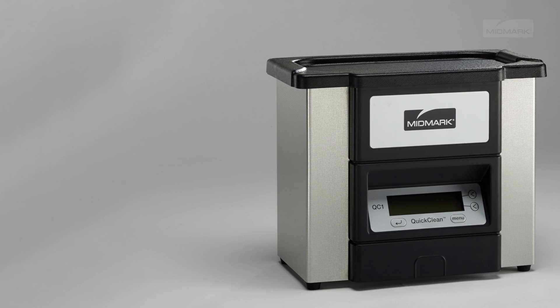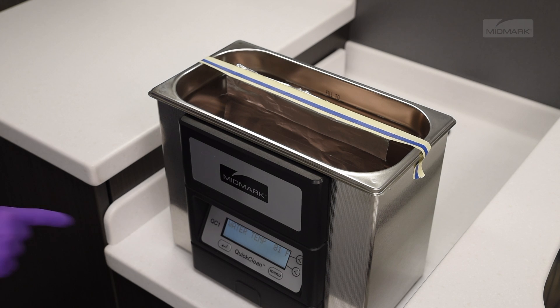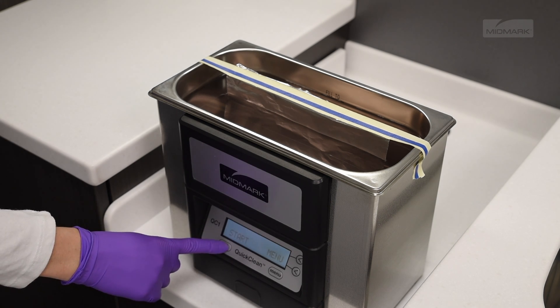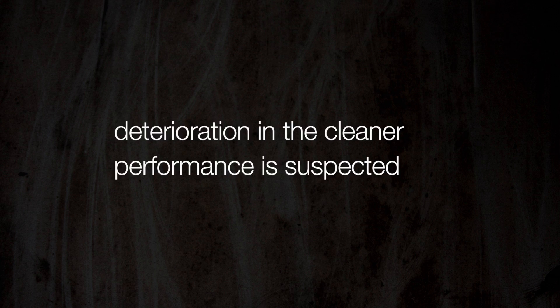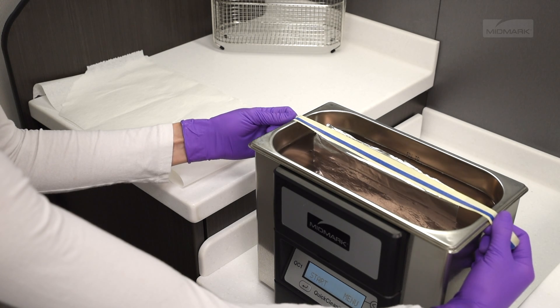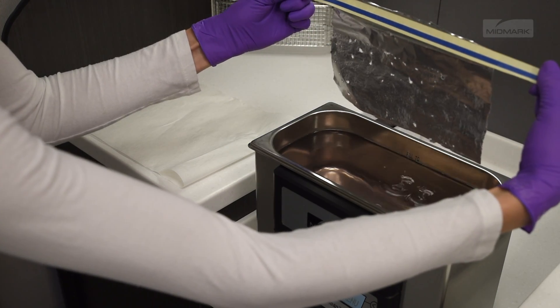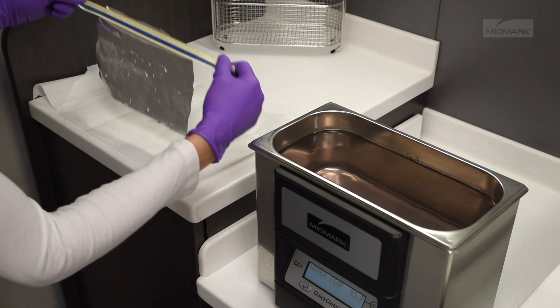The purpose of a foil test is to determine the efficiency of your ultrasonic cleaner. Quarterly testing of the ultrasonic cleaner is recommended. Testing should also be performed whenever deterioration in the cleaner performance is suspected. The foil test is relatively easy to perform and will provide a permanent record for the future comparative evaluation of your ultrasonic cleaner's performance.